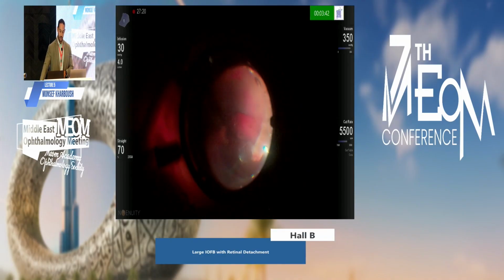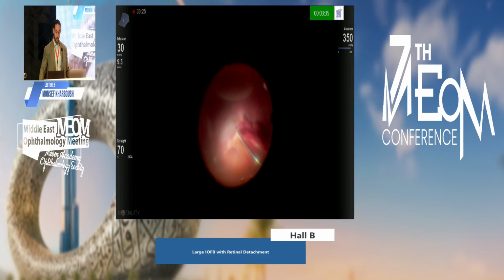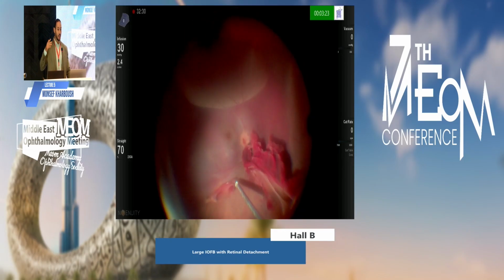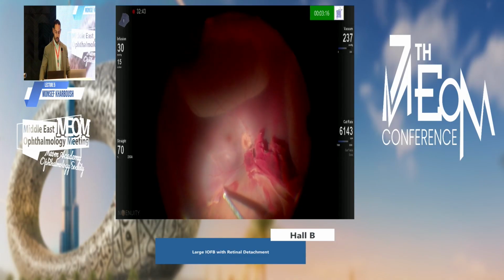And I managed now to see the retina. You can see the retina is starting to show inferior. This is an area of inferior retinal detachment. Now completing our vitrectomy by dissection of this organized vitreous proliferation on the retina, we can see here, nasal to the disc, the area of the rupture which was extending nearly from the limbus to the optic disc and formed some gliosis on this area with the clot of blood over it.